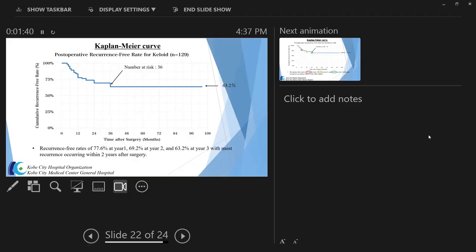In my opinion, the differences aren't very large for a 100 kV beam and a 6 MeV electron beam plus bolus. There are differences, and I think I should have highlighted that specific example, but I don't think the differences are very great there.